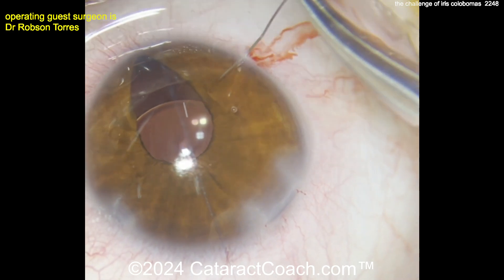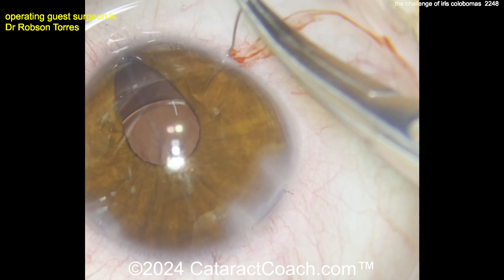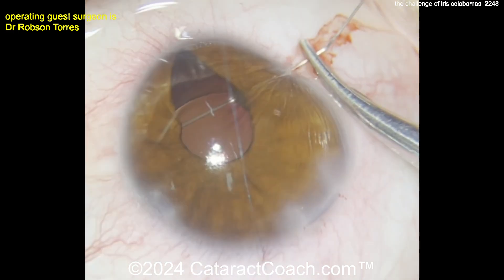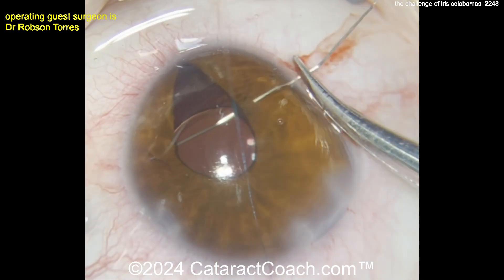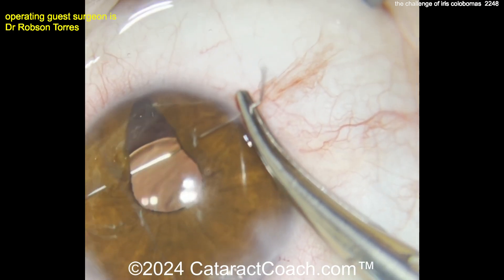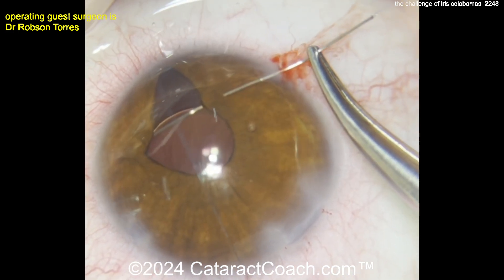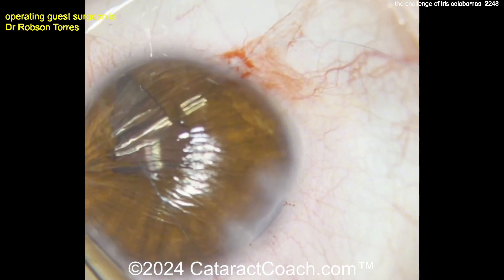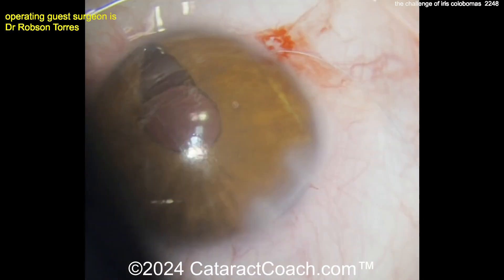A miotic agent has been brought in to bring the pupil down, and now we're going to suture the iris in a pupilloplasty. A nice technique here is to use a hollow bore needle to help guide out the other end. Notice these are good bites — not too close to the pupil margin, because you don't want them to cheese-wire through.